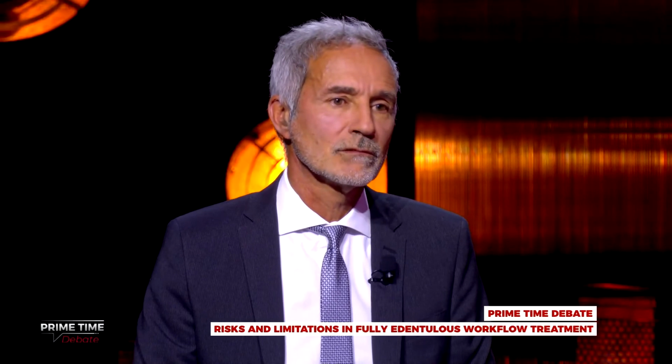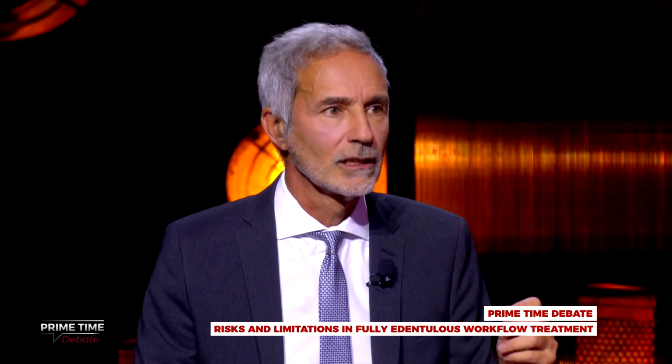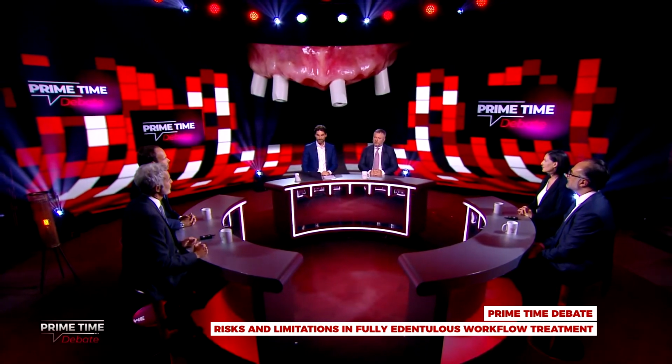It is not simple in the lower jaw, because in the upper jaw we also have the palatal wrinkles that can help the oral scanning, but it is a very difficult procedure. I have to admit this, because we asked the audience to vote on this.